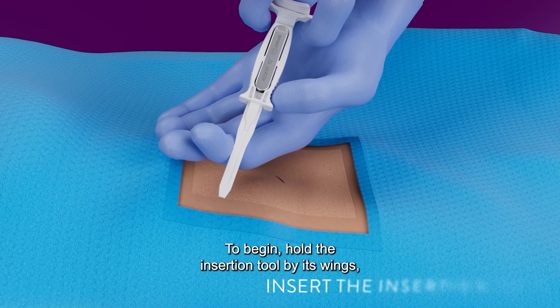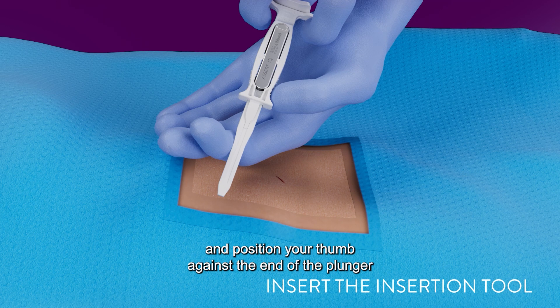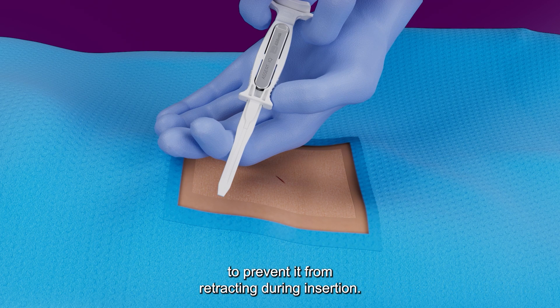To begin, hold the insertion tool by its wings and position your thumb against the end of the plunger to prevent it from retracting during insertion.